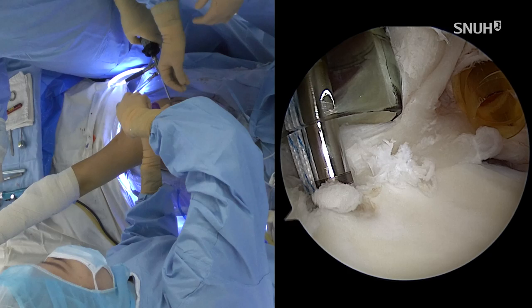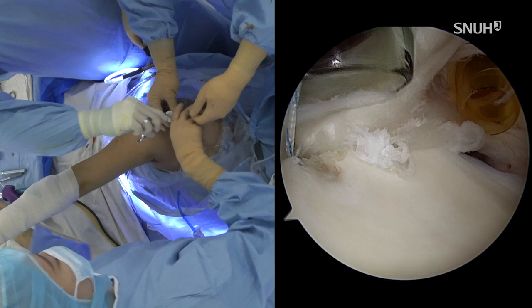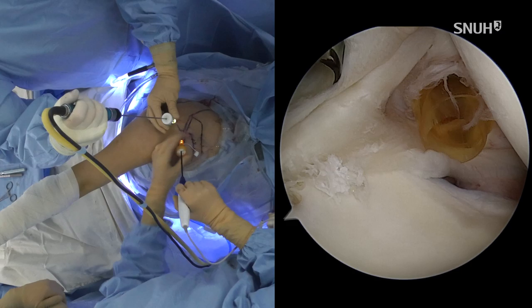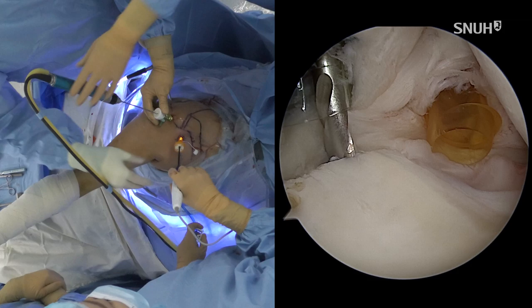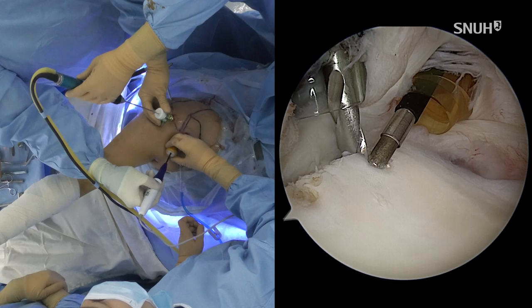So you can screw out, and cut the sutures. Easy, simple, right? So the second suture anchor is for the anterior side. Around here. Stop. Make a mark.